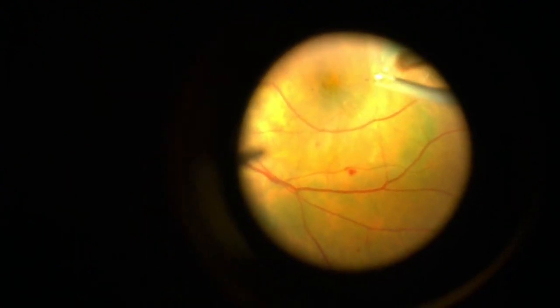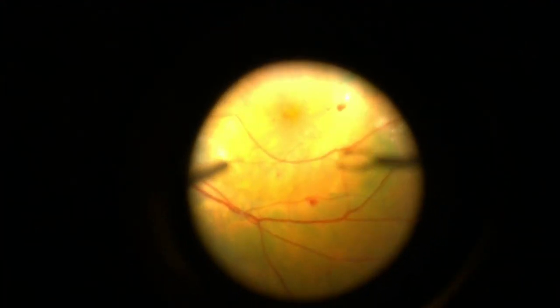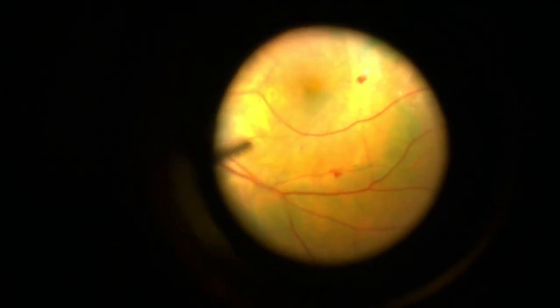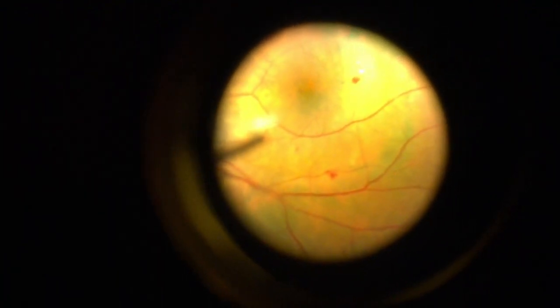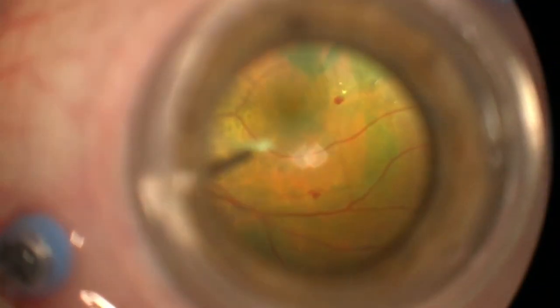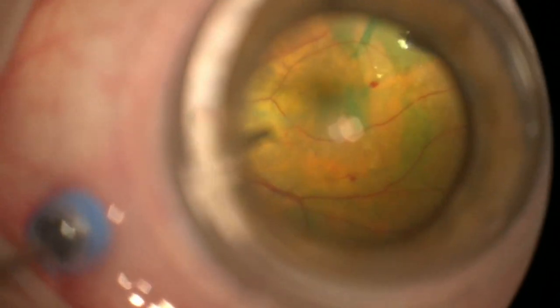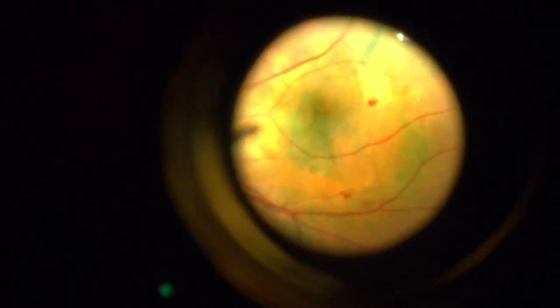You can see how nice that will just go around without having to use that pick at all. I'm going to show you another way to peel, which is with the vitrector. Now, this is probably less common, but these vitrectors are such fine instruments nowadays that you can actually peel the internal limiting membrane with a vitrector quite often.